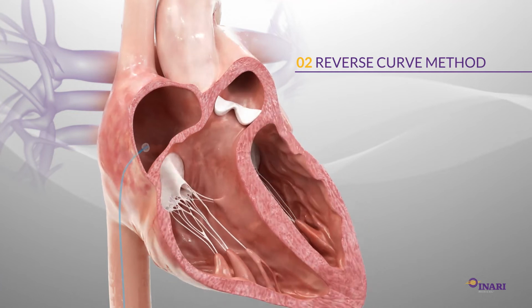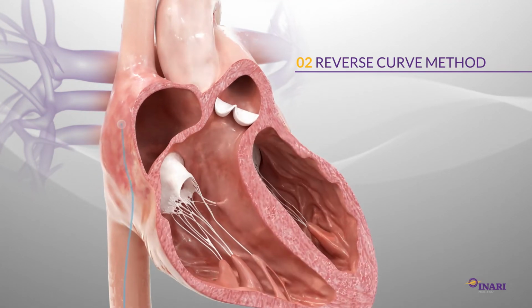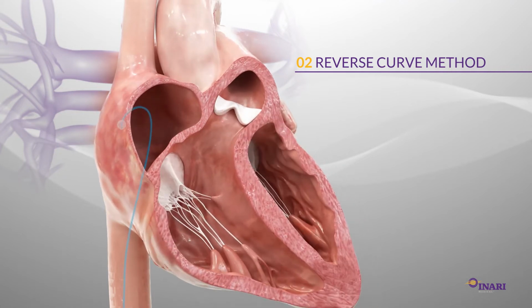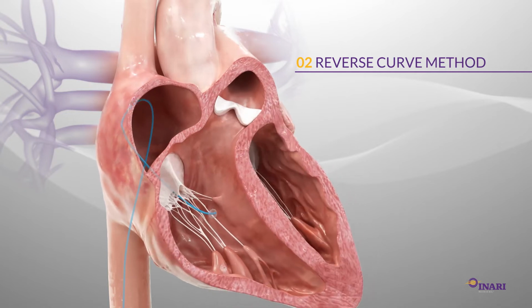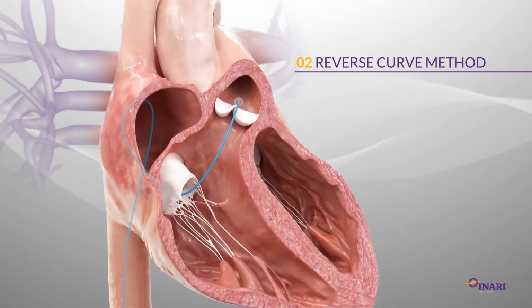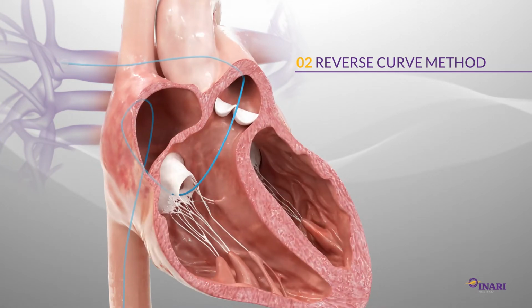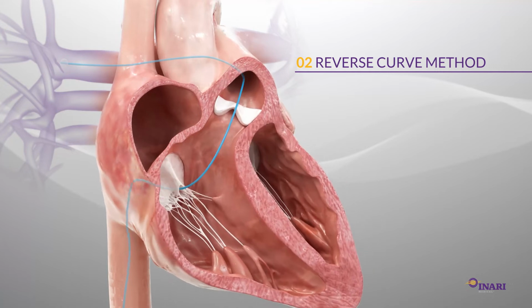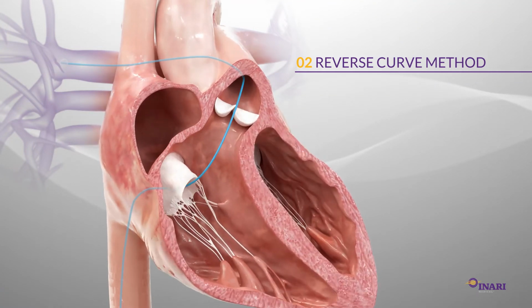It is achieved by orienting the balloon-tipped catheter to the left side of the screen when in the right atrium. Deflection off the right atrial free wall will create a loop with favorable orientation to then pass through the tricuspid and pulmonic valves. Once the balloon catheter has been advanced to the pulmonary artery, gentle retraction of the catheter will reduce the redundant loop in the right atrium, creating a straighter path for subsequent wire insertion.